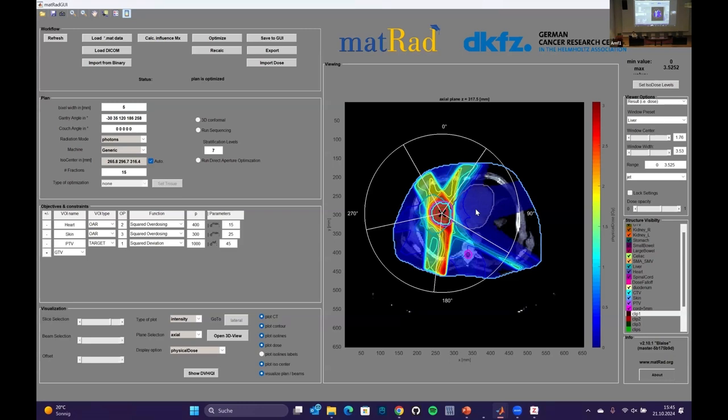Nowadays, we have 2 experimental modules for that implemented, but they are not in a release and they will also not be in the next release. So you can do different optimization approaches. There are approaches, for example, which take long for the initial computations. So you wait an hour, maybe, and then they give you a plan database.